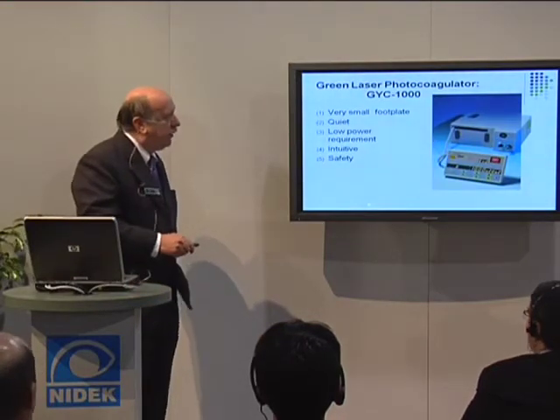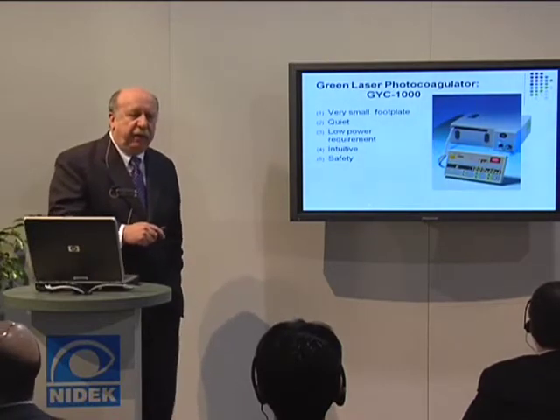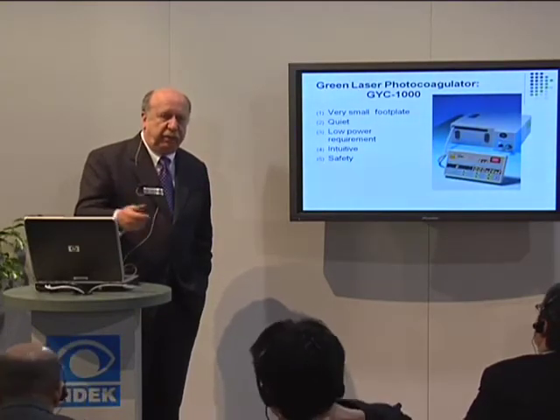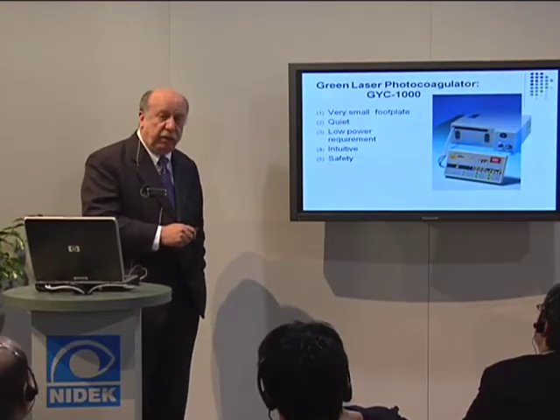This control box, as well as this laser, can be taken from the office. If you have a particular doctor who does some work in, say, vitrectomies and wants an endo laser, this can actually be detached very easily and taken to the OR.